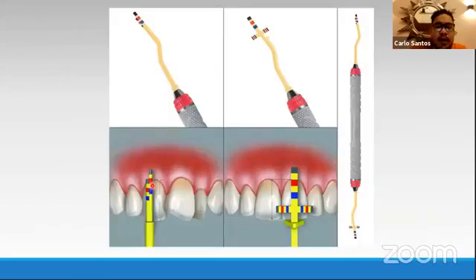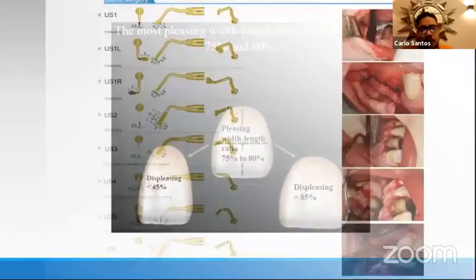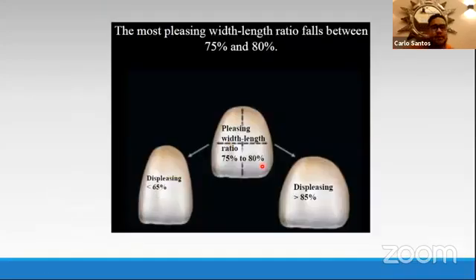Okay, before I show the procedure, these are the tips that we use in doing our crown lengthening procedures with the piezo tip, and osteotomies. Actually, this is for sinus, no? Anyway, sorry. Okay, so I'm sure the aesthetic dentists who are watching know this.